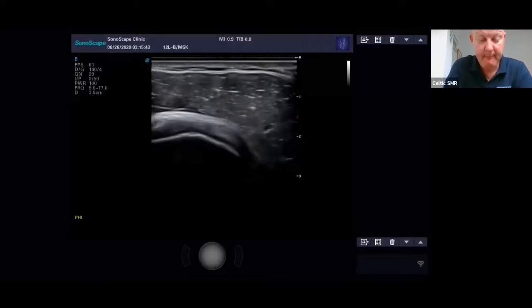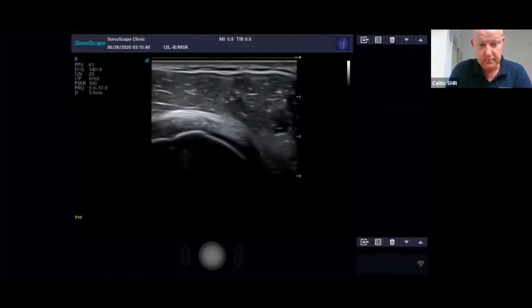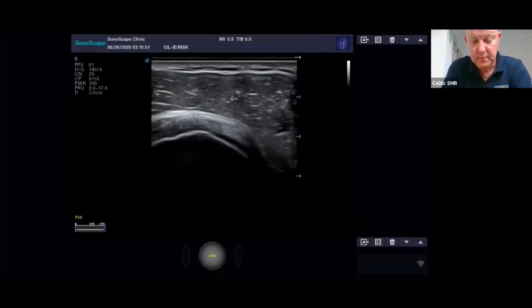Now, the anatomy here, if I just freeze it here, what you've got is the greater tuberosity. This is the superior facet, and then this is the middle facet. So here is actually the only place where you're going to visualize the supraspinatus, and this is infraspinatus. It's not all supraspinatus, it's just literally here.